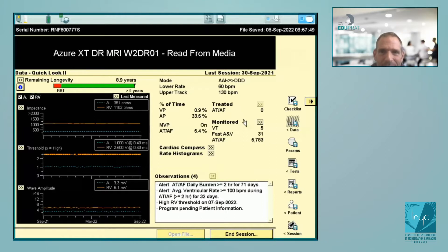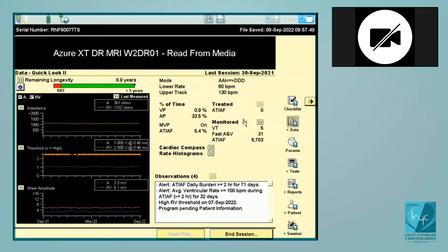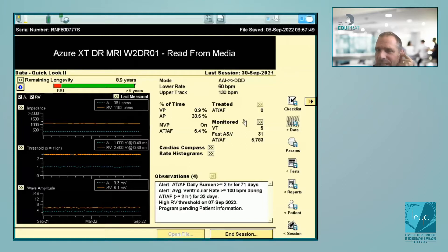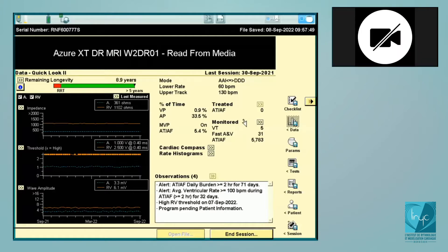First pacemakers and then ICDs — we're going to see from the very beginning the basics of interrogation of the different devices, to things a bit more complicated. We're going to talk about devices from the different companies. Today we start with Medtronic pacemakers and we're going to see the basics of how to interrogate, the different steps of interrogation of the dual chamber pacemaker.